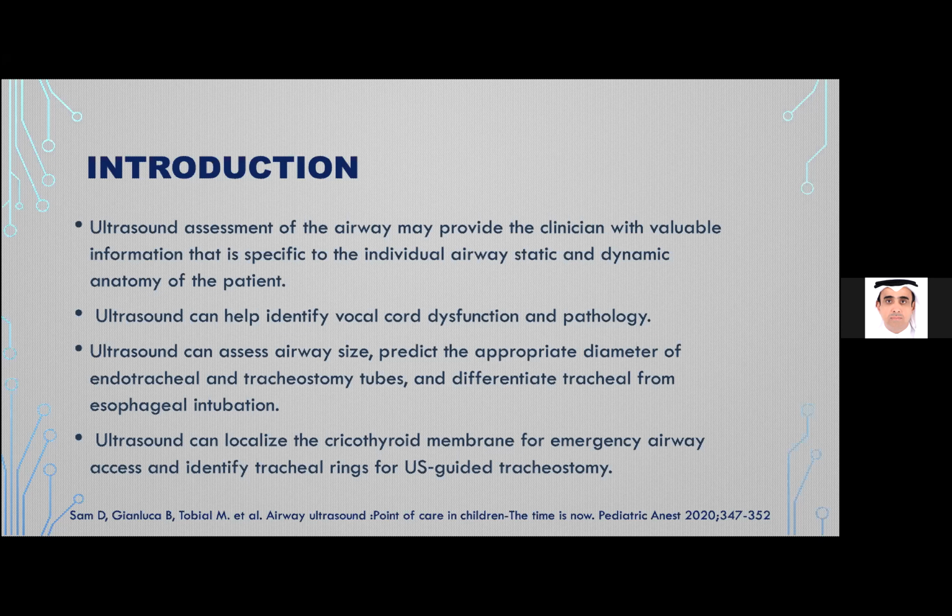And to be guided by it, or to go for the tracheostomy. First of all, you have to be familiar with which probe to start with. It's very important. Do you go for the curved linear, the high frequency, or another option? No, you need a very high frequency for this patient. So it's very important to select the correct probe, especially if you are dealing with pediatric age, where you face a lot of obstacles.